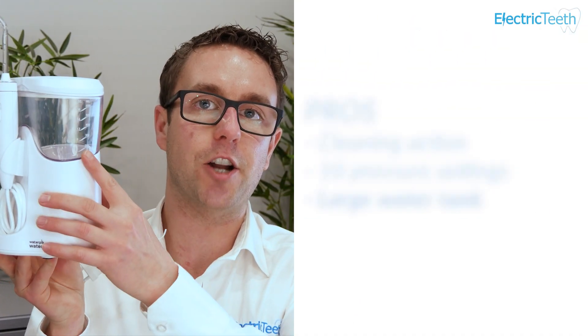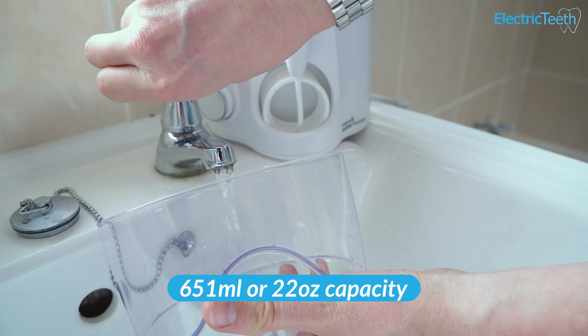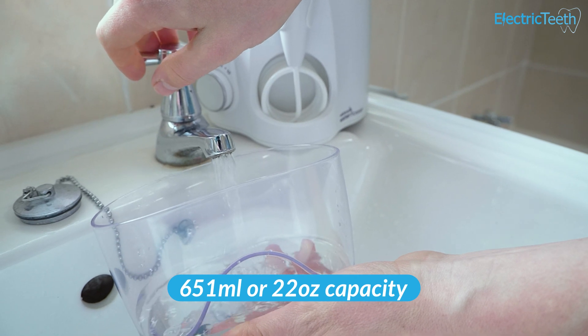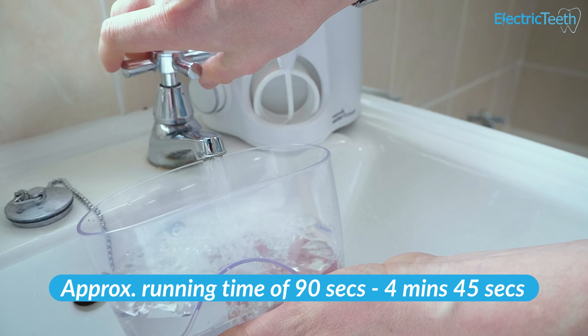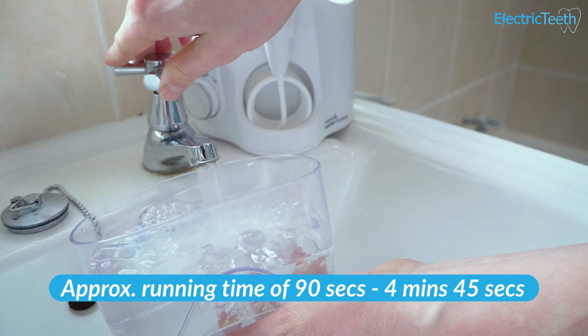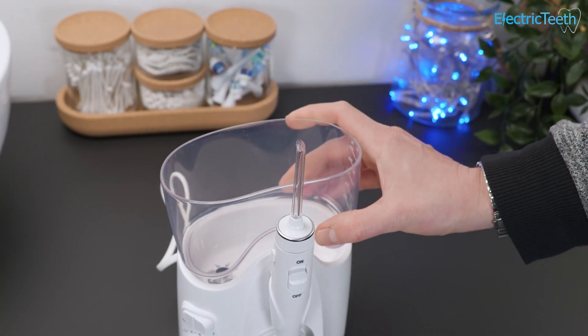Another pro has to be the large water tank or reservoir on the Ultra Plus. It has a 651 milliliter or 22 ounce capacity, which means you have a running time of somewhere between 90 seconds and 4 minutes and 45 seconds. If you have it set to the highest setting of 10 that gives you 90 seconds of use from a full tank, or you can get up to 4 minutes and 45 at the lowest setting.